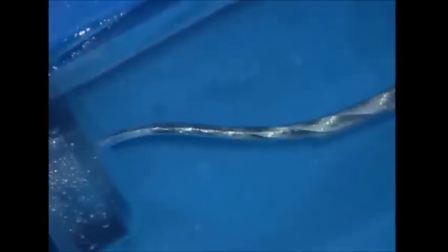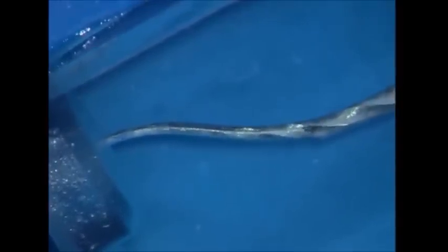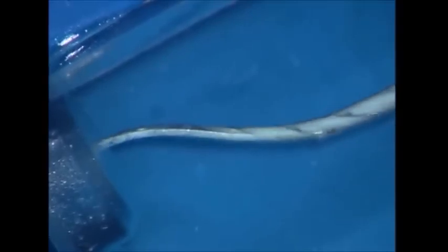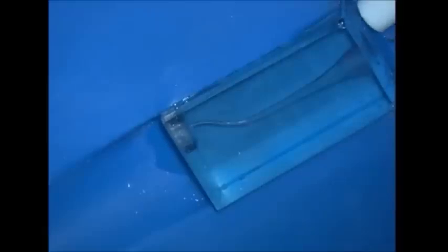Again, the pre-curved instrument bypasses the ledge. Its greater diameter cutting blades refine and smooth and plane the walls and begin to reduce the ledge even further. This instrument is worked until it achieves length. After every greater tapered instrument, irrigate, recapitulate, and re-irrigate.